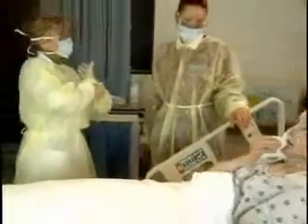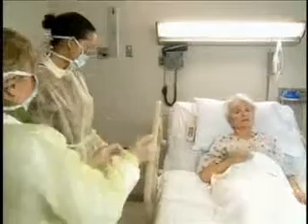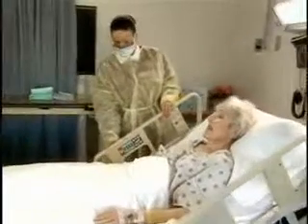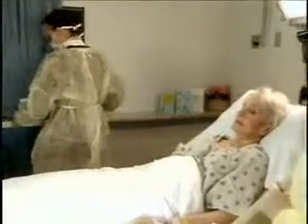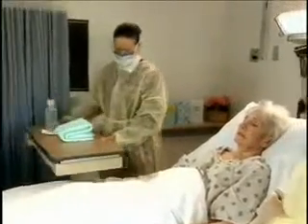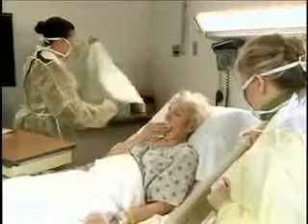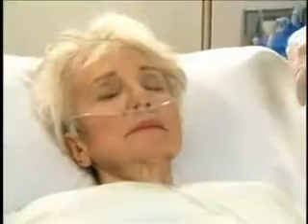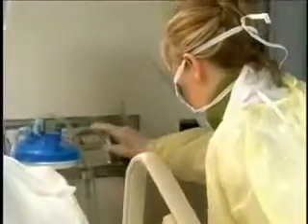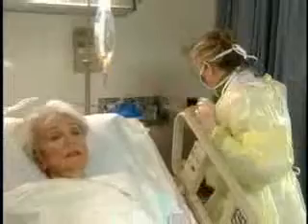Okay. I think I'm good. So let's get you into position. I'm a righty, so I'm going to be on this side. Okay, then I'm going to go around to the other side, Anna. Let me lower these rails. And let's get this across your chest. All right. Can you turn on the suction unit? Sure. Here you go.